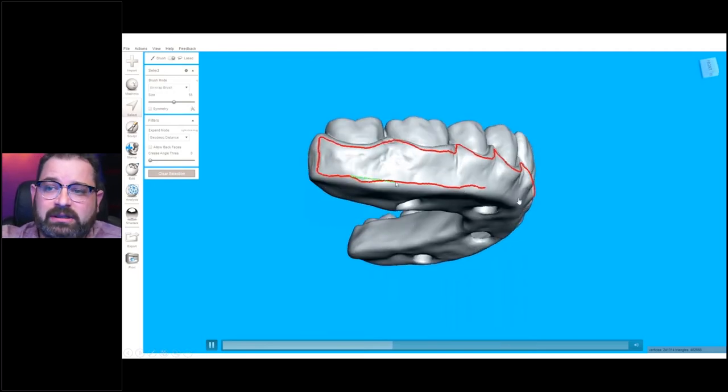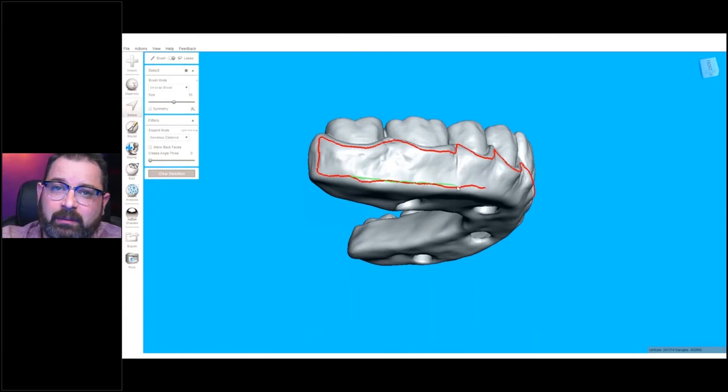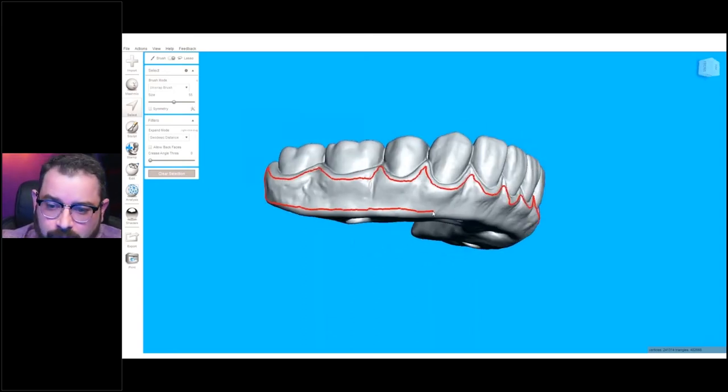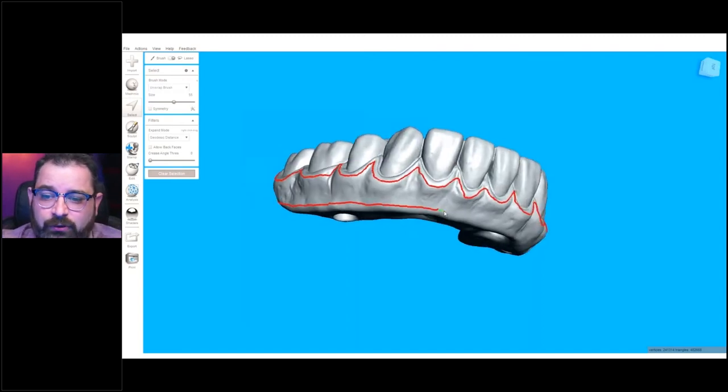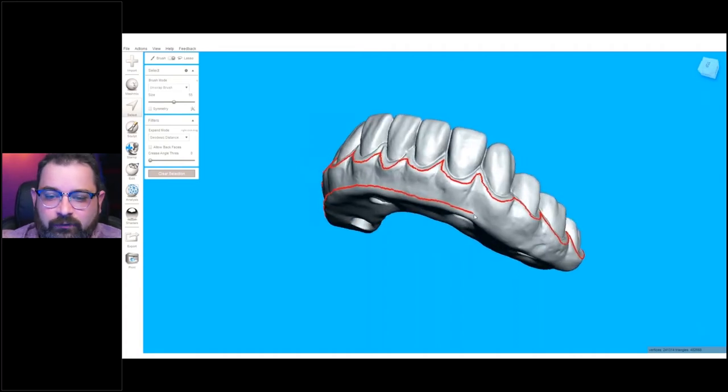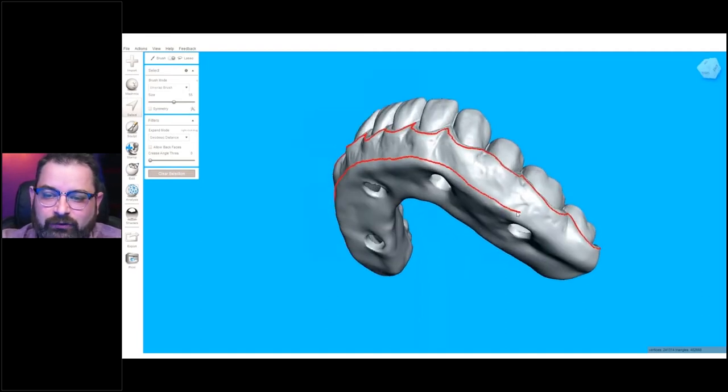With a hybrid top restoration like this one, not going all the way to the bottom might not be a big problem, because it's not really relying on tissue support to create stability. But if you're doing a tissue-supported one, the reason you want to stay away from the bottom edge is because that's the area for your border molding. So it's very important not to mess with that. For hybrid, you can go lower if you need to.